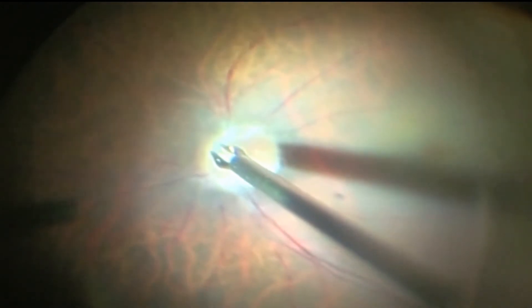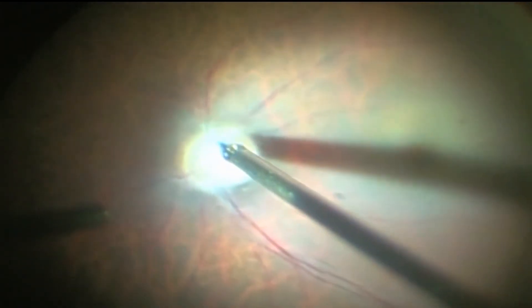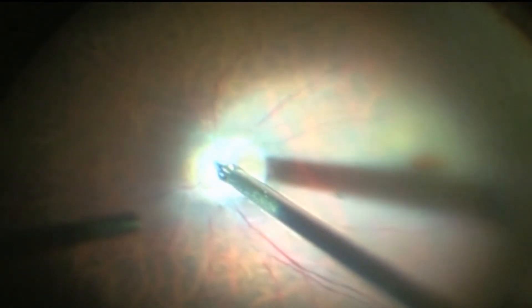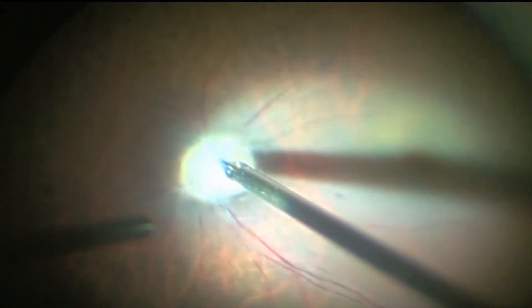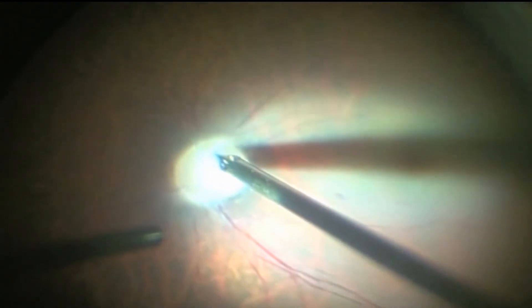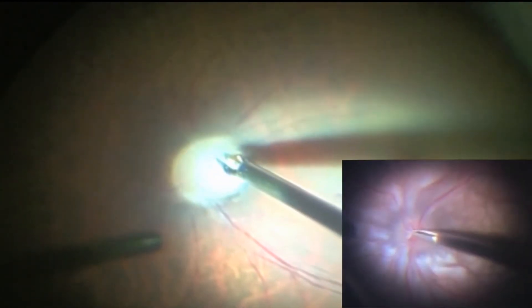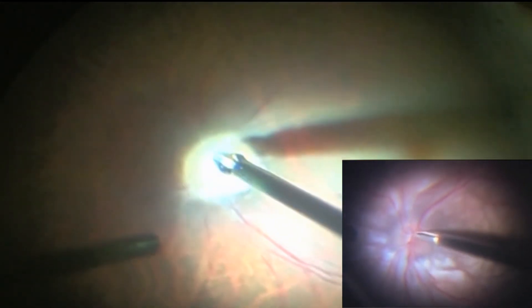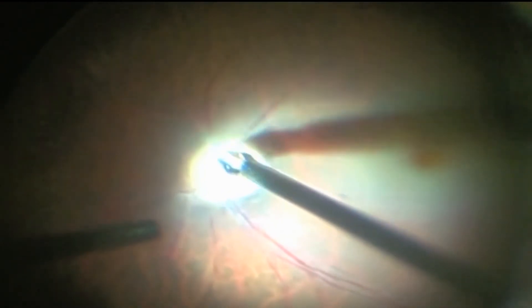The arterial sheath and the central meniscus of Kuhnt take a faint blue stain with brilliant blue. The arterial sheathotomy with the dissection of the central meniscus of Kuhnt was done very carefully from centre to periphery in a radial fashion. The optic disc dissection is not seen very clearly in this surgery since a light pipe was used instead of a chandelier. Hence, the inset shows a similar step done in another case using a chandelier. This dissection also helps us to massage the central retinal artery directly.